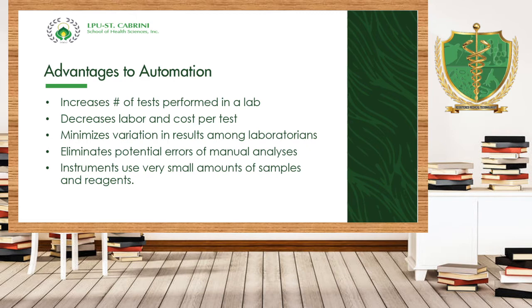We have to stick with the manual one because some hospitals or laboratories have a reason for not wanting automated clinical microscopy: it's the only test that can be done in a conventional way. If you automate it, medical technologists lose their skills and rely too much on the machine.